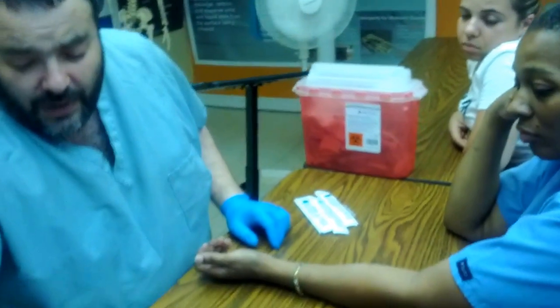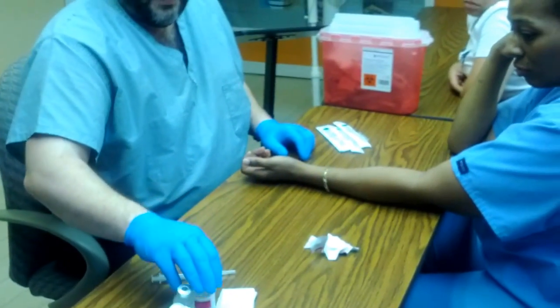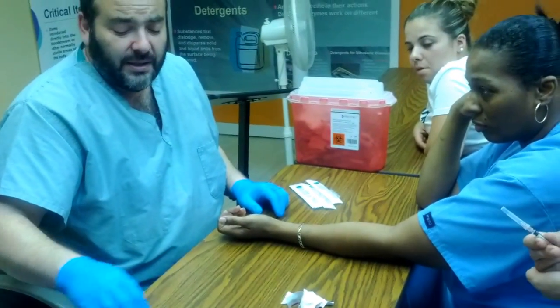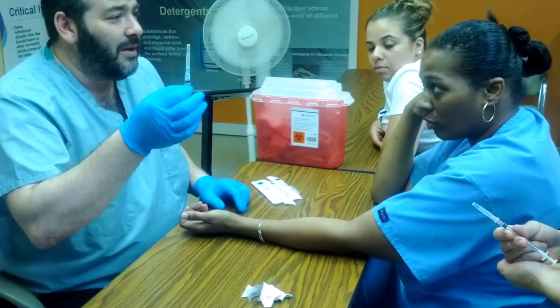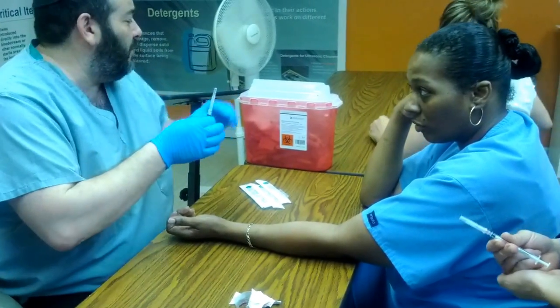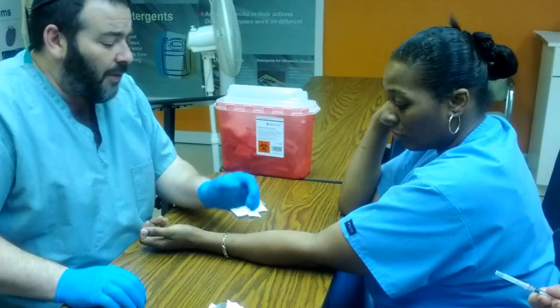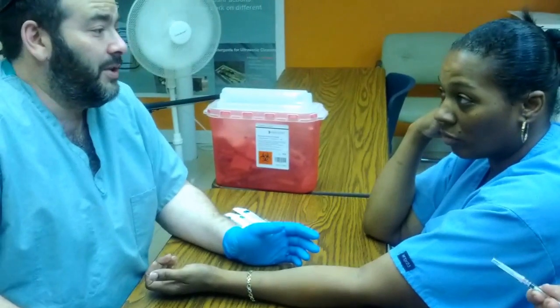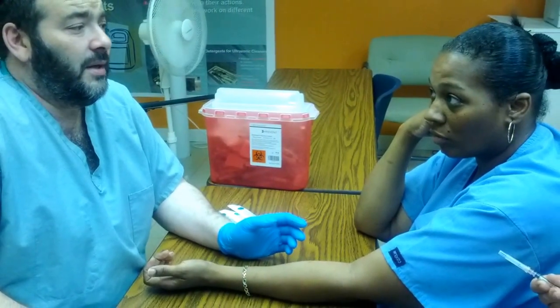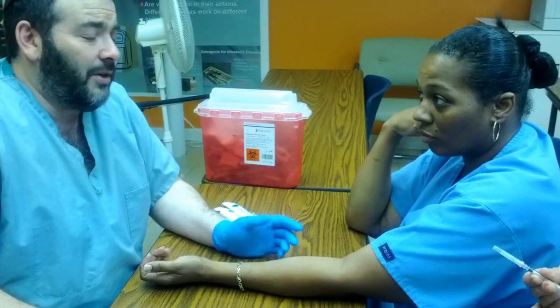All the supplies you have used, you're going to be throwing out. The rules of medicine are such that when in doubt, throw it out. If you don't know whether something has been used or unused, even if there's a shadow of a doubt, throw it out. Now, instructions to the patient: make sure that after you've completed your TB test, you ask the patient to sit for 15–20 minutes after the injection in the lobby, just to make sure they don't have a severe allergic reaction.